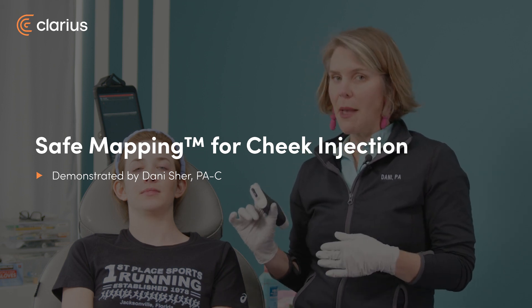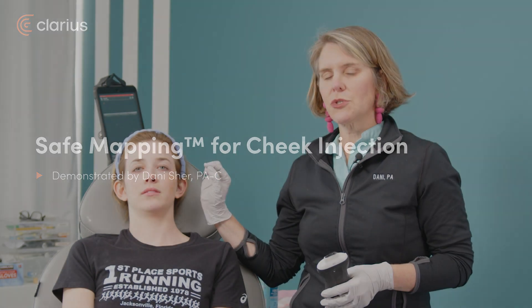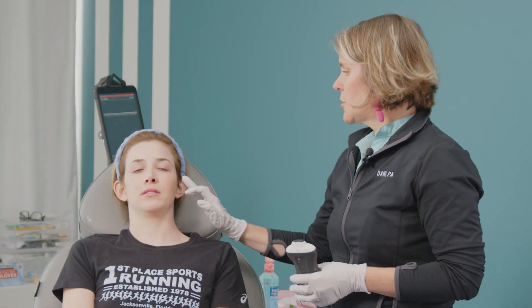Hi everyone, we are talking safe mapping. We are going to do a needle bolus on Grace's cheek. What does that mean? We want to check to see if it's safe. So just looking at Grace, what we always start with for safe mapping is: where do we clinically want to put the filler?